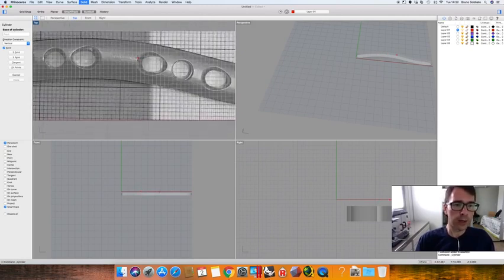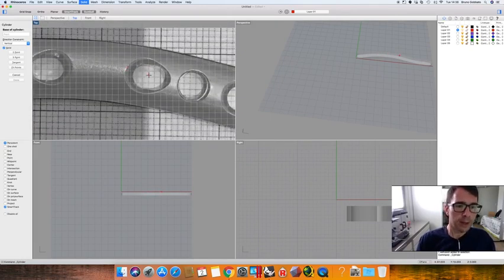We're going to draw it over the exact center of the hole. Just click, I have just clicked, and now I can move the diameter wherever I want. Okay, so we can choose by hand the diameter using the image, or we can choose it just clicking here.